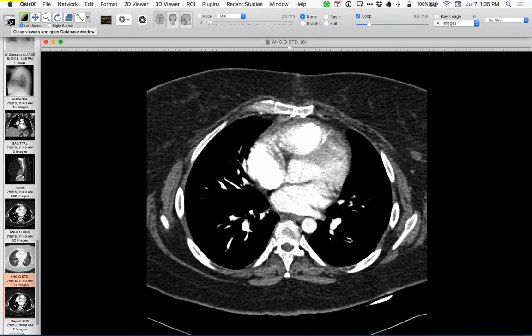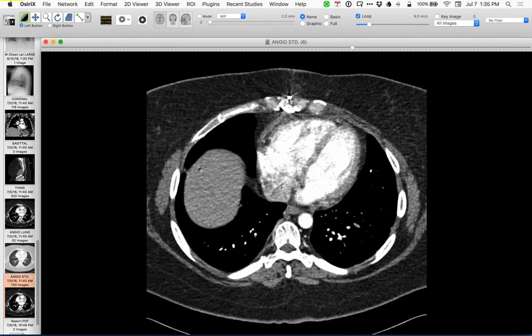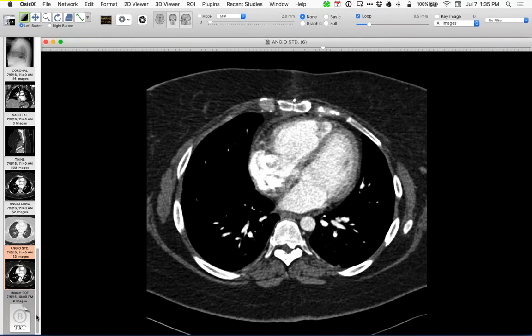All right. It looks like her right ventricular distension also decreased. And yeah, those chambers are smaller. Yeah, a bit smaller. Yeah, that's impressive. I wonder if she'll still have her tricuspid insufficiency, though, because that annulus might have stretched out.